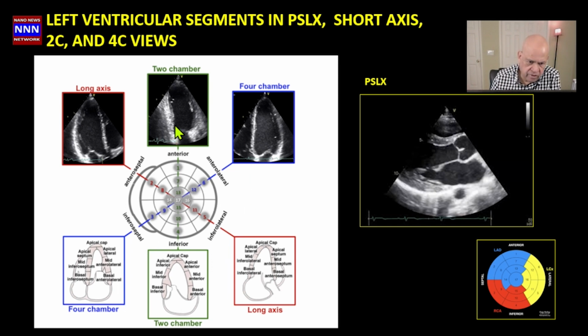Whereas with echocardiography, since we can see these wall motions, the next issue is the lack of endocardial delineation, which makes it extremely difficult to assess the wall motion abnormalities, because we are not seeing the entire thickness of the ventricle or the entire outline of the ventricular wall, and hence using contrast may help us enhance our ability to recognize regional wall motion abnormalities.